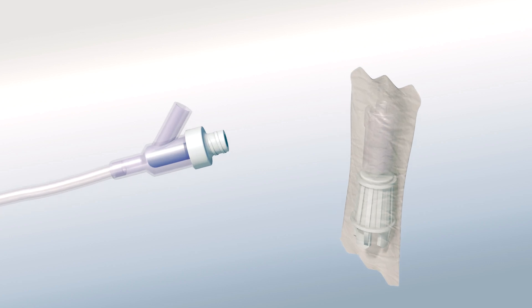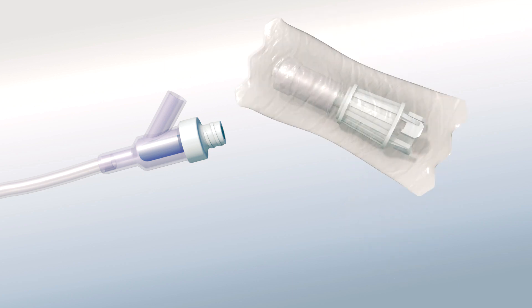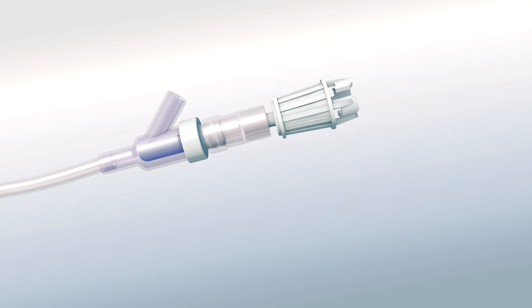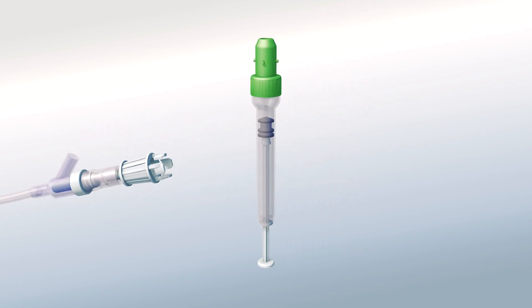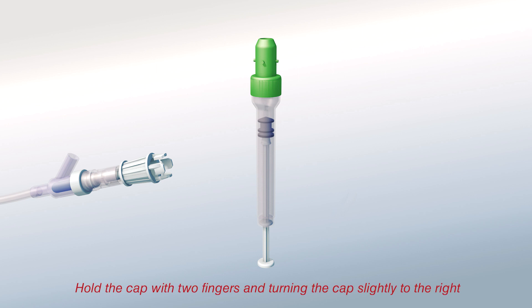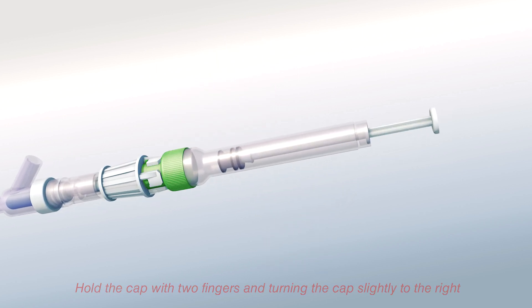To begin your blood draw, first disinfect your port or heparin lock according to your hospital's policy. Then remove your lure lock adapter from the packaging and attach it to the line. Now, connect the lithium heparin Monovet to the adapter by holding the cap with two fingers, pushing into the adapter and turning the cap slightly to the right.